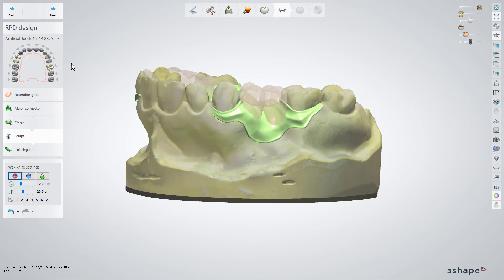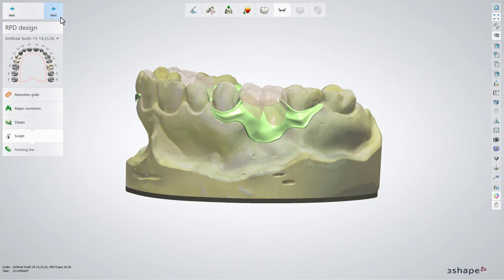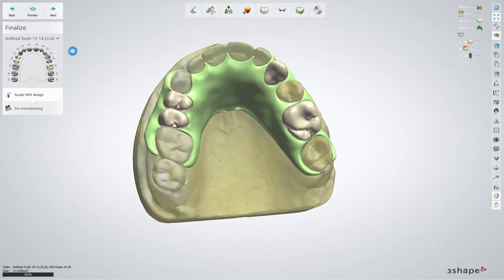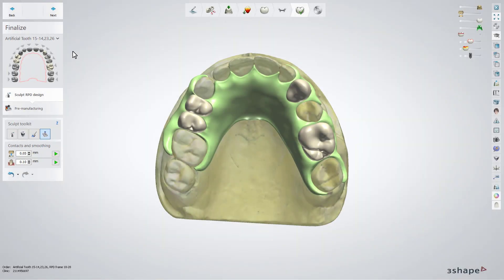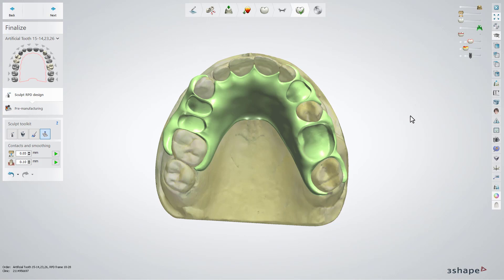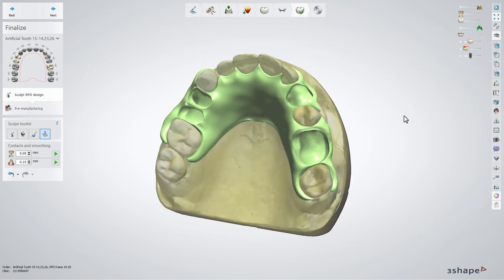Now you can move to the sculpt RPD design sub-step. Click on the contacts and smoothing option. This option will create the pockets for the artificial teeth. Set the desired value depending on the cementation material which will be used later, and press the create pockets for teeth button to apply it. To check the results, make the teeth less visible with the help of the visualization slider.